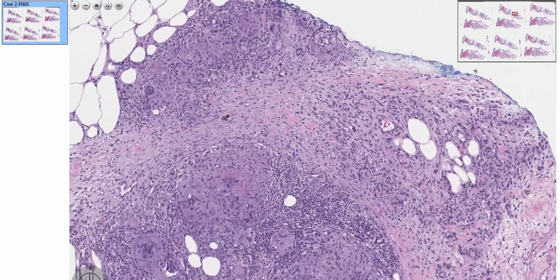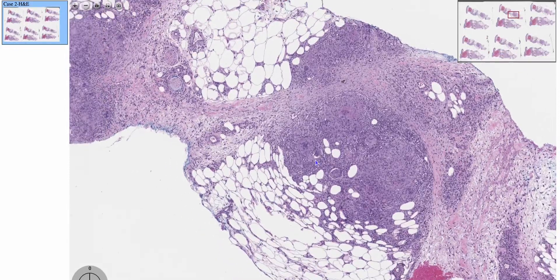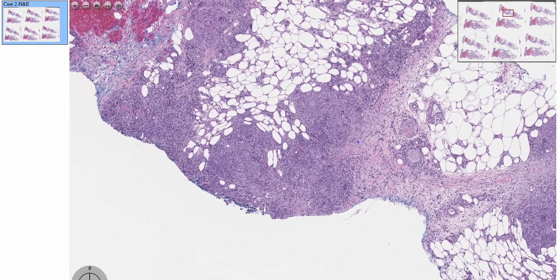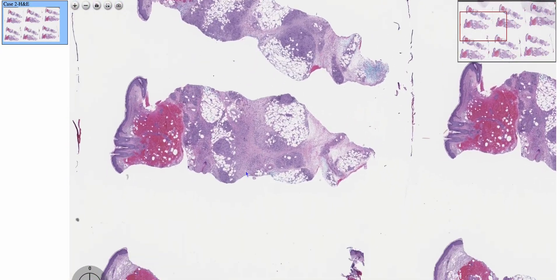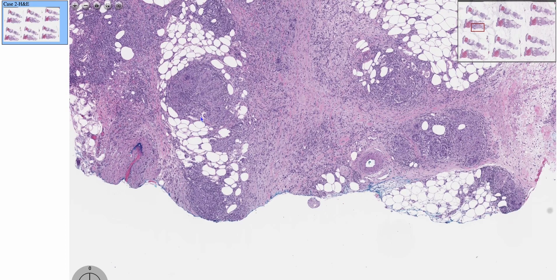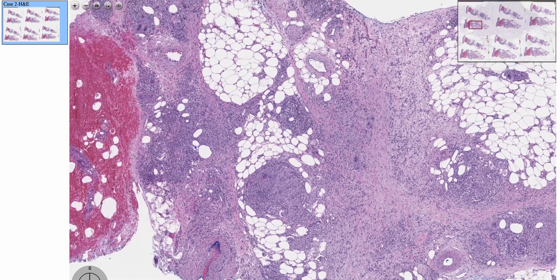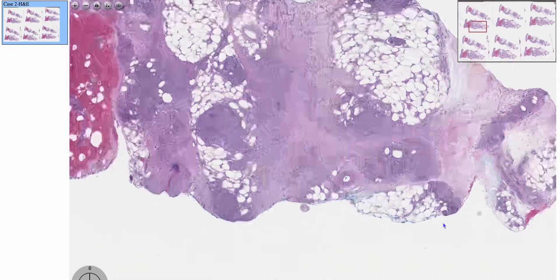What these are — let me try to find a good one — are these collections of histiocytes. The reason why they're called Miescher radial granulomas is because these granulomas will have a cleft-like space. There's some cleft-like spacing here as well. Sorry, I couldn't find the best example, but they are here.